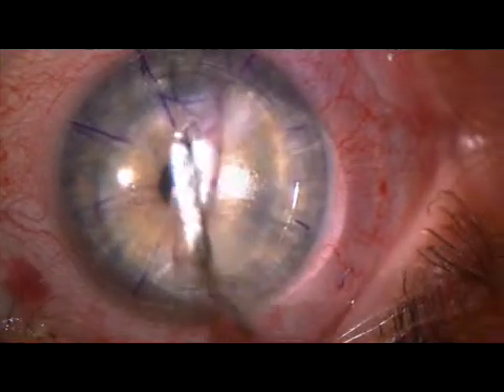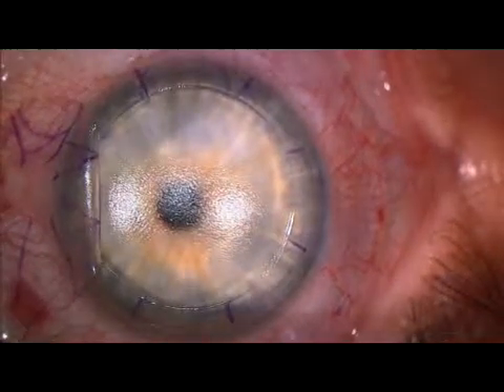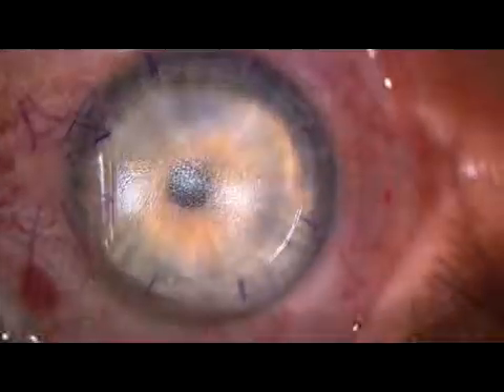The corneal flap, which measures 99 microns, is lifted without the need to break adhesions. The underlying stromal bed is uniform and pristine.